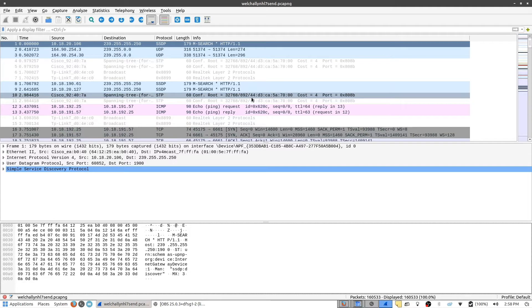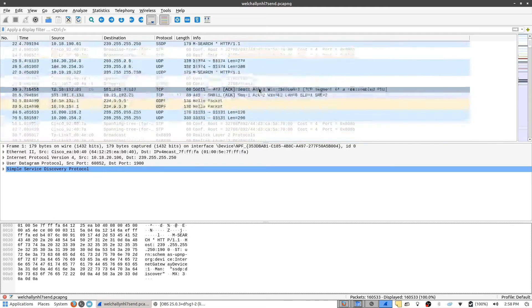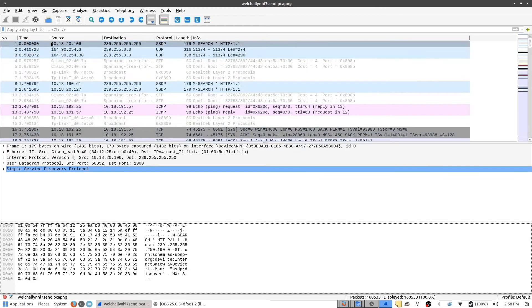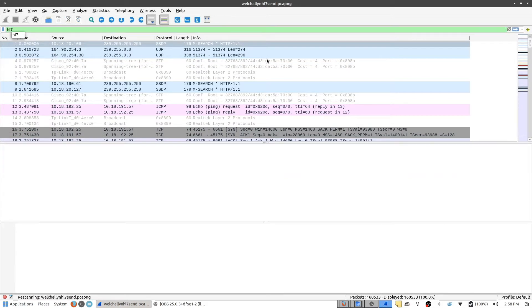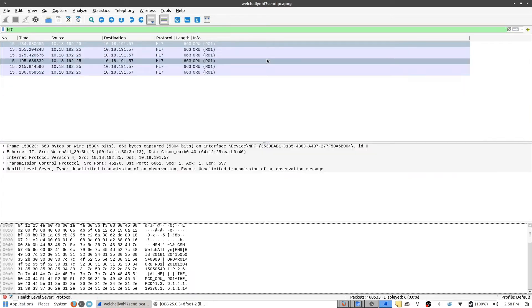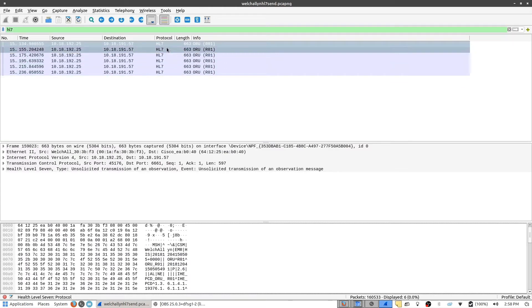So obviously we don't want to go through these one by one and try to figure out what we're looking for. At the top here with the filter, which says 'apply to display filter', you can just type in HL7 and press enter. Wireshark will start narrowing down automatically the packets we want. You can see these six packets here for HL7.